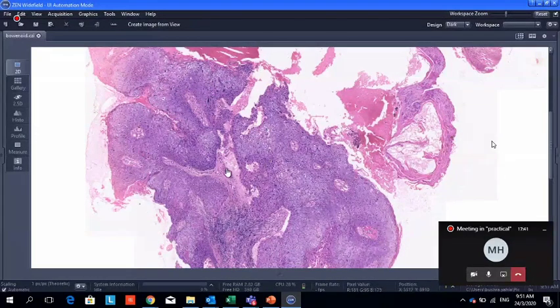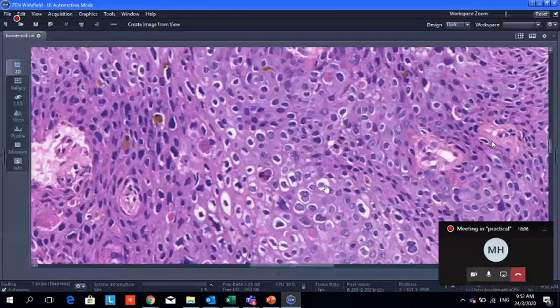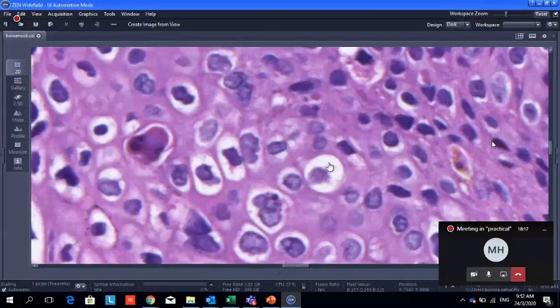This one, the tissue, which is the epidermis and the dermis. The changes are only in the epidermis. Okay. So it has not metastasized yet, because metastasis must first invade the underlying tissue, then invade the blood vessels and lymphatics, then metastasize to other organs. Coilocytic changes are just changes inside the cells. You see the perinuclear halo or clearing surrounding the nuclei, which is actually due to the HPV infection.